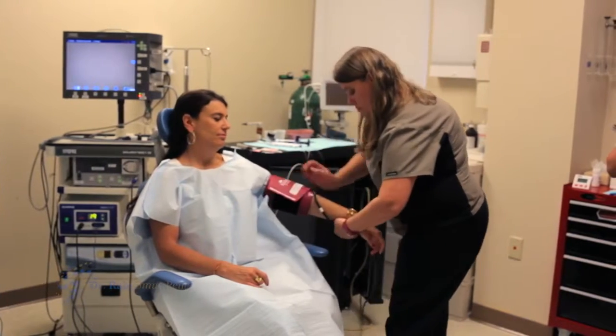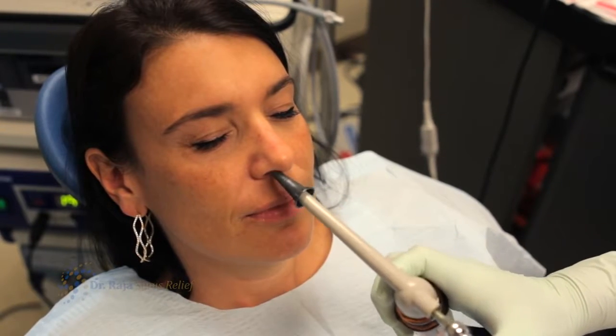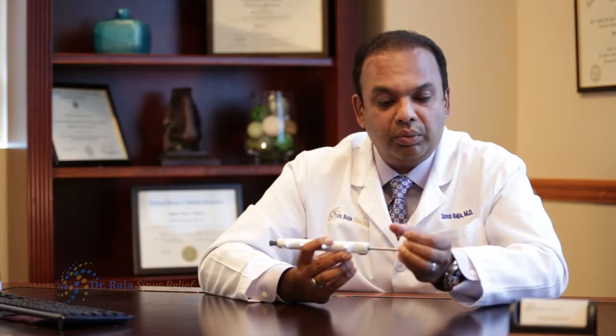And once we can locate the exact natural opening of these sinuses, we advance with the second lever a balloon, similar to what they do in cardiac catheter surgery, and we inflate it to a substantial pressure. And what that does is it remodels the bone that surrounds the natural opening, which is honeycomb thin, sponge-like, very airy, and basically pushes it against the hard skull bones of the face, leaving that opening permanently more open.